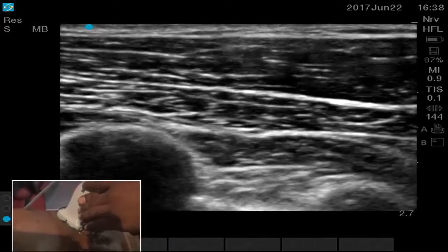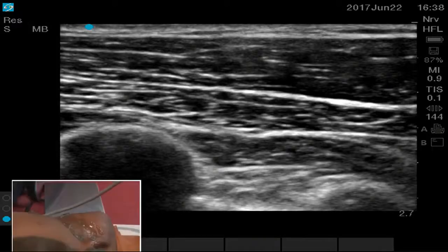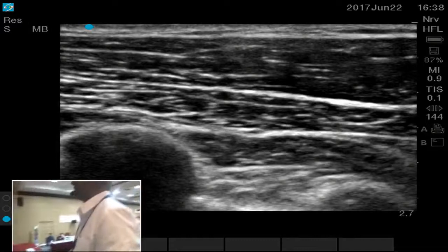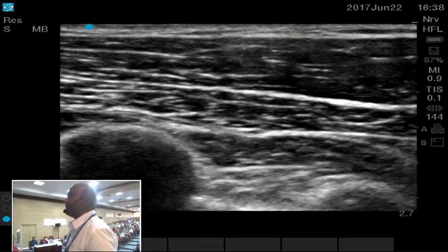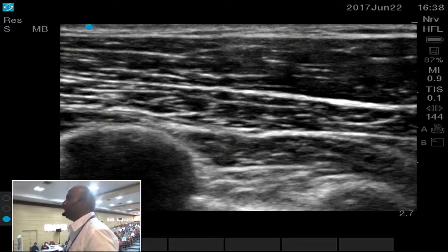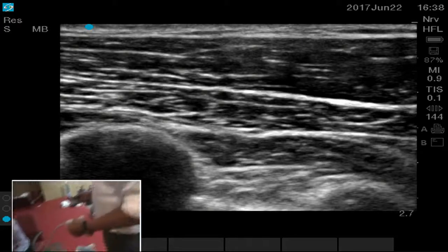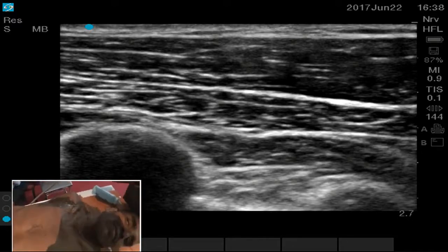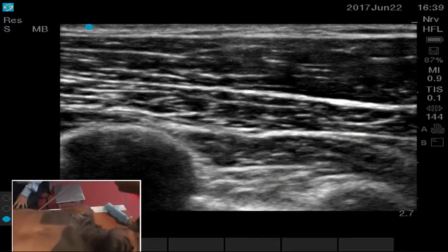Freeze it. Now here you are seeing the three muscles. The one on top is the pec major and this is the pec minor and this is the serratus anterior. So the local between these two planes, between major and minor, is pec 1, and between minor and serratus, this plane is pec 2. Because these pectoral nerves travel in this plane and then come back to this, it requires both the planes to be blocked for an effective block.